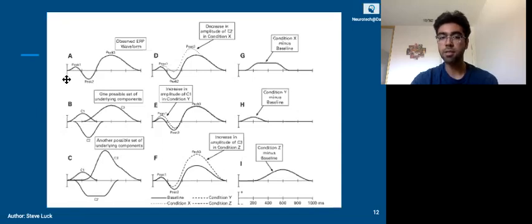So if I just saw this on an electrode and assumed that the peaks directly translated to peaks in ERP components, I'd be completely wrong. In fact, the component only peaks at 100 milliseconds. So be careful when you look at the data, because it's really distorted and it's hard to make significant conclusions.